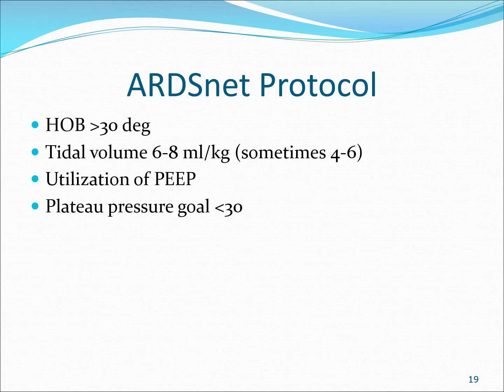The difference is, with the low tidal volume strategy, they utilized PEEP. They used higher levels of PEEP early on, where the other group got PEEP a little bit later. While they were doing this study, it was determined very, very quickly that the patients with the low tidal volume strategy had better survivability, better blood gases, and better outcomes, and they stopped the study immediately. In other words, this study was supposed to go on for say a year or two, and as a result of the findings, it was so drastically better to use low tidal volume.